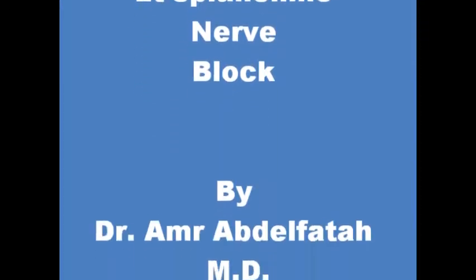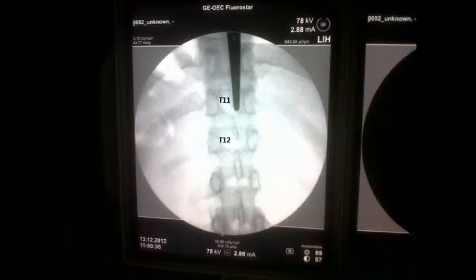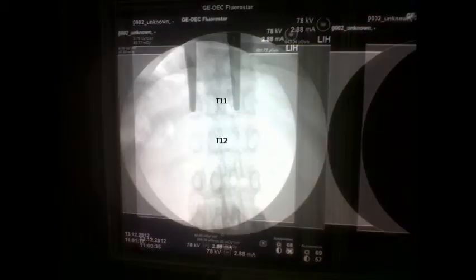The splanchnic nerve block is a procedure performed to relieve pain from abdominal and retroperitoneal structures. While the patient is placed in the prone position and with the aid of fluoroscopy, the T11 vertebra is identified.